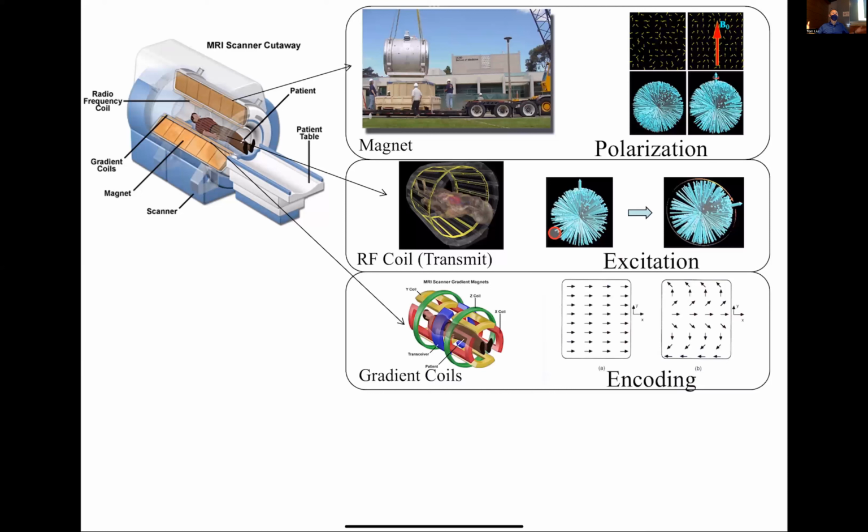If you go in for an MR exam, typically the first thing they do is what's called either a localizer or a scout. They want a very quick image that can be done in about 10 seconds, just to say where the body or the head is, so they can then prescribe the image based on that. That's done with pulses that go very quickly, where you say, I don't need much signal, but I just want to go fast. So there are these trade-offs you can make.